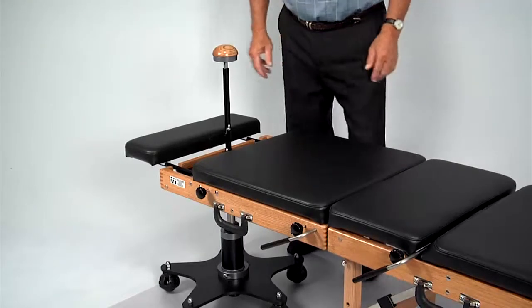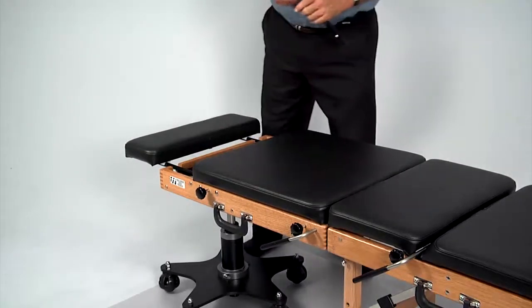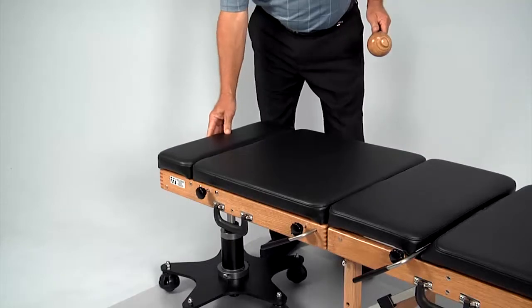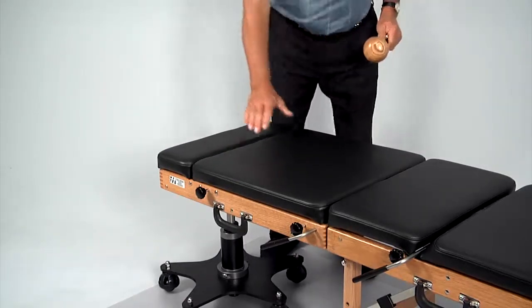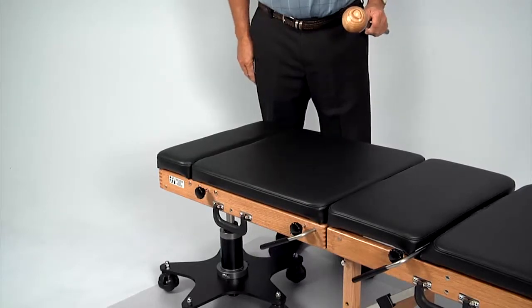When the flexion distraction device is not needed, the control knob and mast can be easily removed. Simply turn the mast locking lever counterclockwise until it is parallel to the floor, then remove the mast. The flexion distraction device is now locked and deactivated, and your portable table is ready for standard operation.